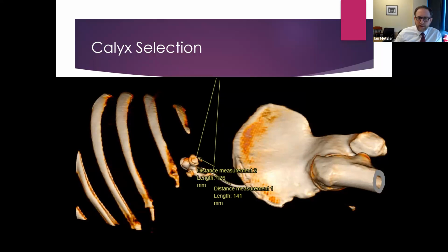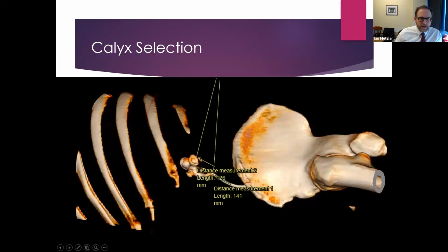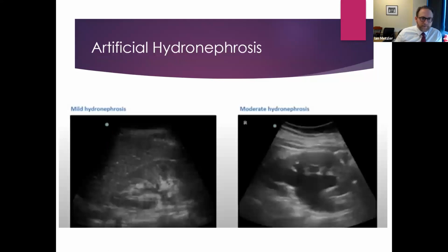And in fact, this middle pole calyx here, which is actually invisible on this retrograde, it's actually right here, this darker calyx overlying the renal pelvis is the one that's full of stone and is pointing up straight at us. And so fluoroscopy, you wouldn't see that, but on ultrasound, it's the first thing you see. I don't have a picture of that particular patient here, but the posterior calyx full of stone would be pointing right up at you. Like you can imagine this posterior calyx pointing right up at the probe and being full of stone, and that's the one you're going to hit because it's the one that's closest to you.